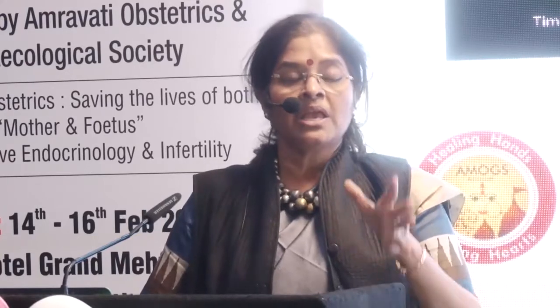Now, Lancet in 2015 came out with a paper on screening of fetal growth restriction and universal third trimester ultrasonography in nulliparous women. This is called the POP study, that is, the pregnancy outcome prediction study in 2015, and they said that a routine third trimester ultrasound in a patient who does not have any other high risk really does not have much benefit.